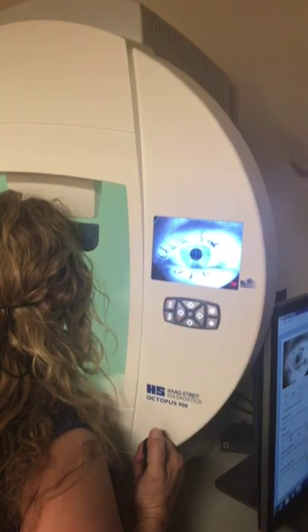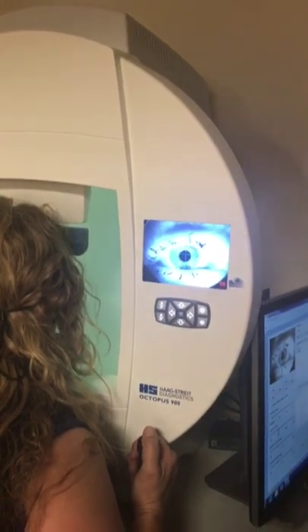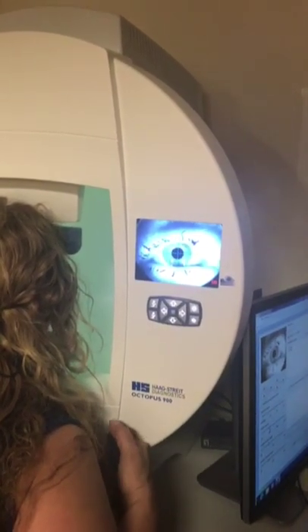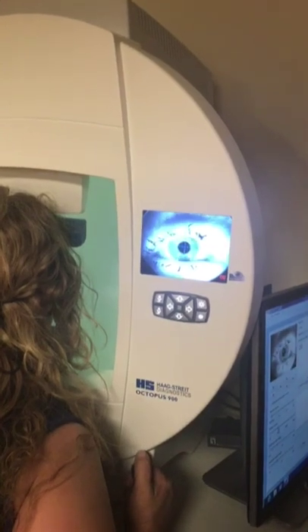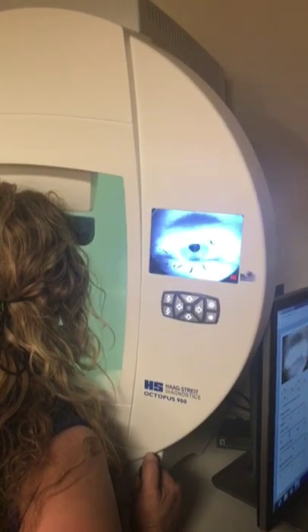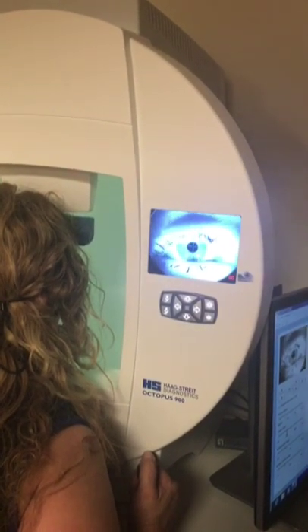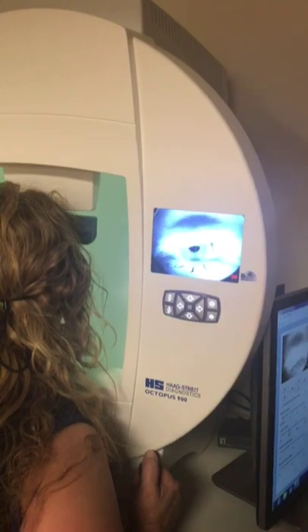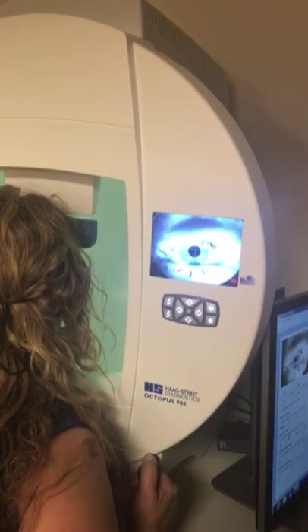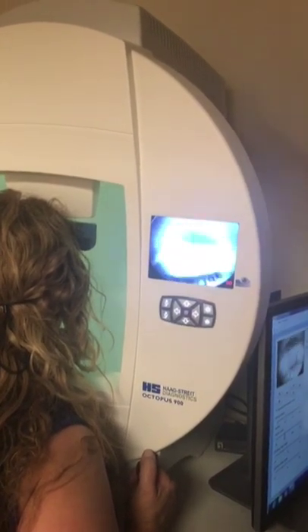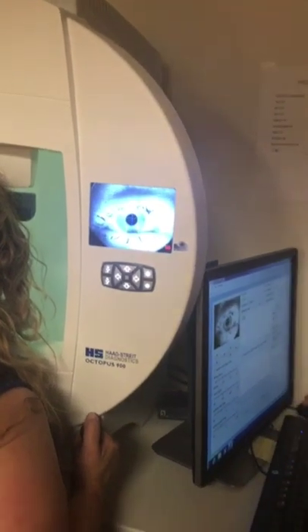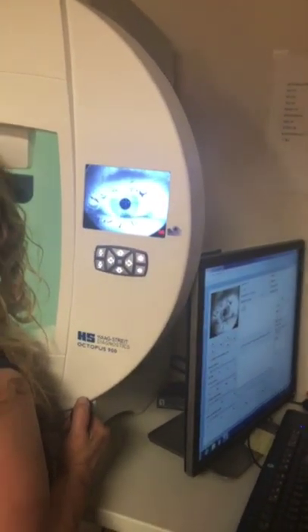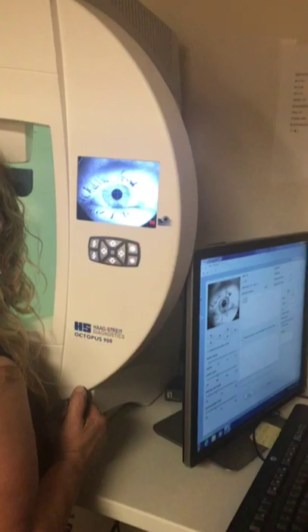Alright, what you're going to do is always stare straight ahead in the middle of the four green lights. You're going to blink as often as you need to. If you see any flashes of light anywhere at all on the screen, even if they're dim, you're going to push the button I gave you. And remember to blink if you need to. Any questions? Alright, here we go. Starting now.